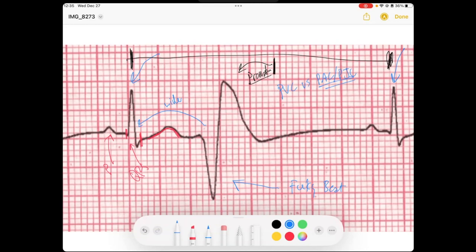But here, this is a wide QRS. So we know that it could be either a PAC with aberrancy or it could be a PVC.